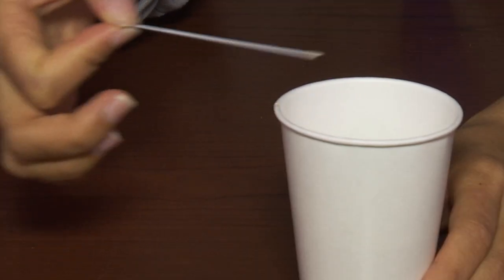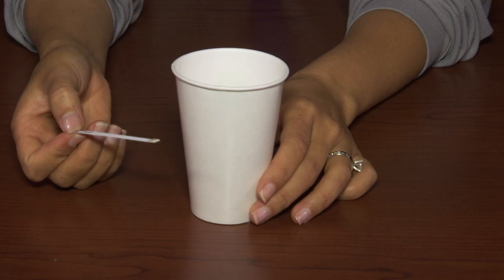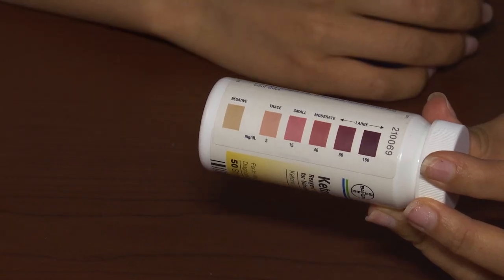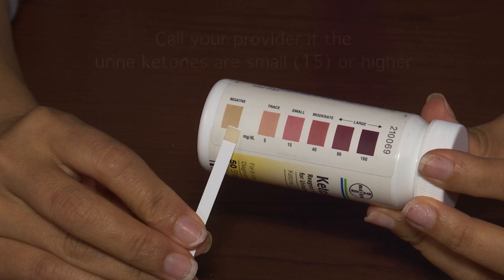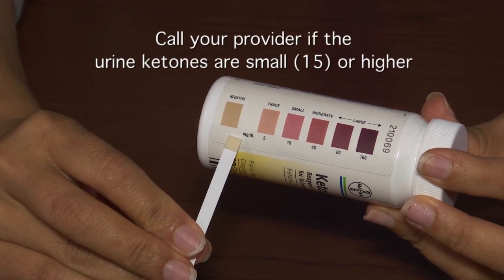Draw the edge of the strip against the rim of the urine container to remove excess urine. Wait exactly 15 seconds after removing the strip from the urine, and compare the test strip test area with the corresponding color chart on the test strip bottle.